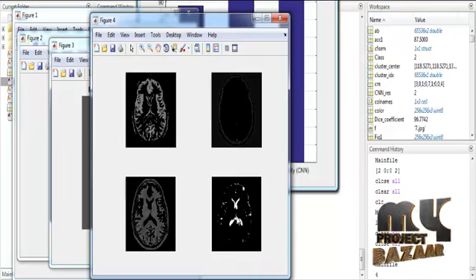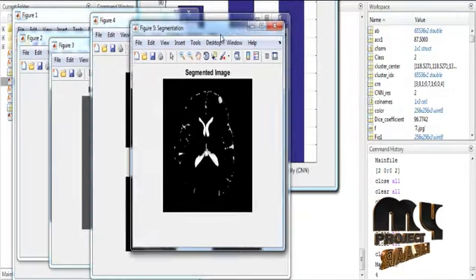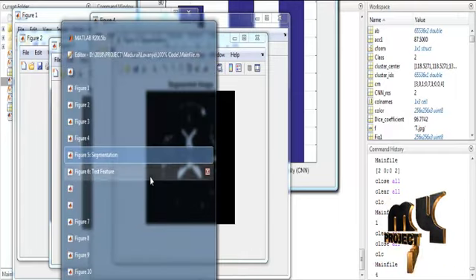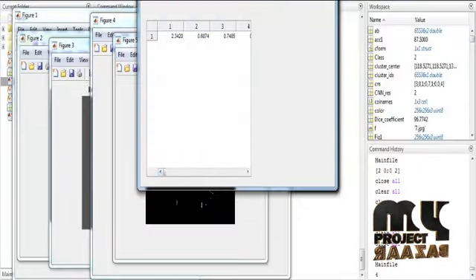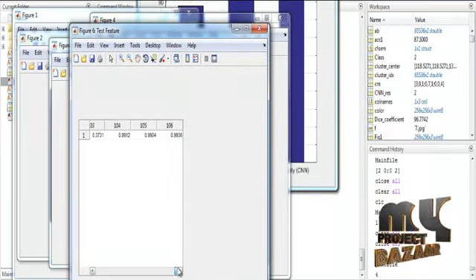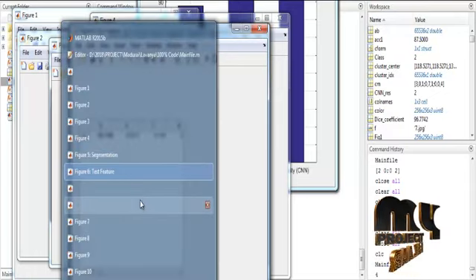At last, we have to select index 4 as the appropriate segmentation. Now the segmented image is shown in figure 5 with the title Segmentation. Then the features will be extracted from the segmented image. Now the GLCM feature values are shown in table 6 with the title test feature.